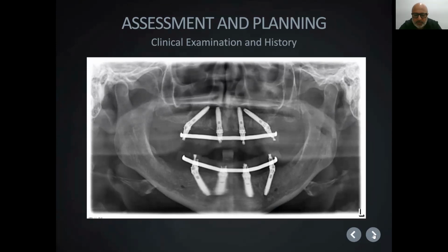These were placed, when we do this procedure, we place the front 2 implants approximately where the laterals are, upper and lower. And the posterior implants we want coming out at an angle as far back as possible, really. We angled these at about 30 degrees. So these would have come out round about the premolar or molar.